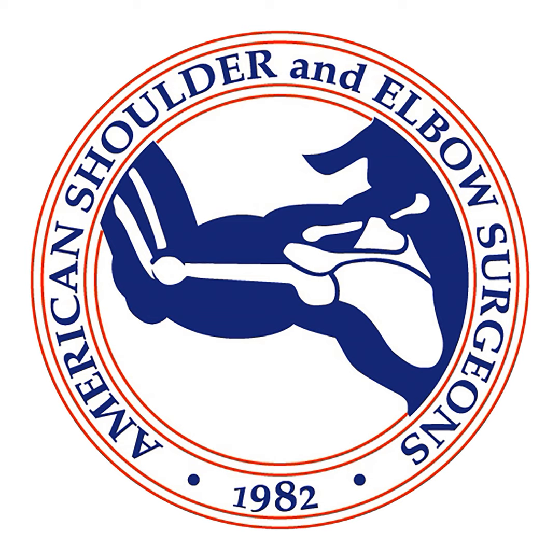I'd say in the last 2 or 3 years, I've had 1 or 2 cases where we made the humeral neck cut and it looks good, and then you push on it and your thumb falls through into wet yellow marrow fat, where there's just no bone below the humeral neck cut. In that situation, I guess you could try to cement a stemless implant, but the best option would be to use a stemmed implant.